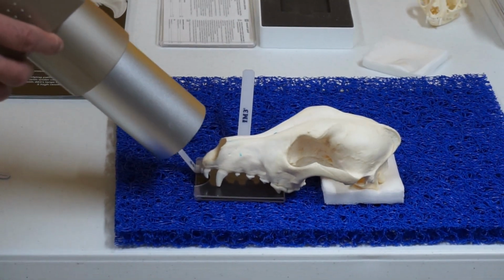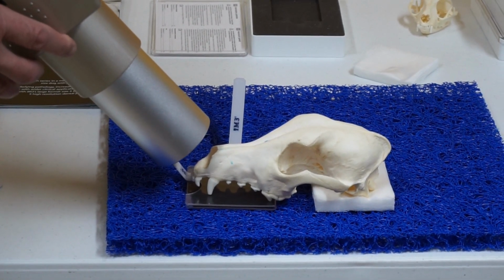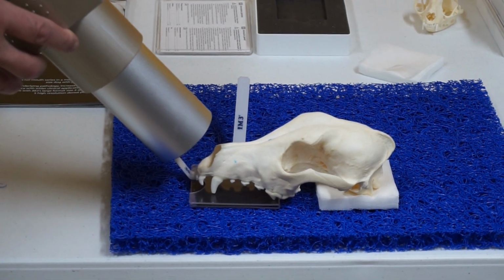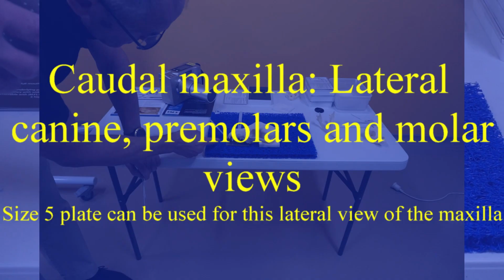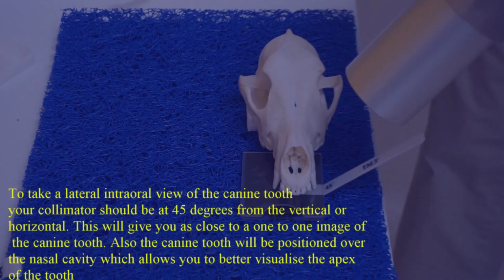So with this tool you can actually use it as an angle guide. It's set at 55, but that's from the horizontal, so it's about 35 degrees from the vertical.